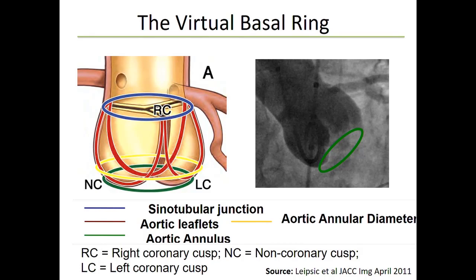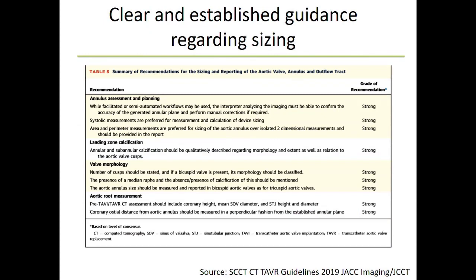So of course, the doctor mentality is that this is bad and we have to avoid it, so we're going to do this. But we ignored for a decade the 80% of patients that were undersized that did not leak. And of course, the engineering mentality is that we need to learn why 4 out of 5 patients were undersized and did not leak. And I think the drivers behind that relate to the very complexity of what is determining device sealing and device capturing. And that goes well beyond our historical approach of simply annular geometry.